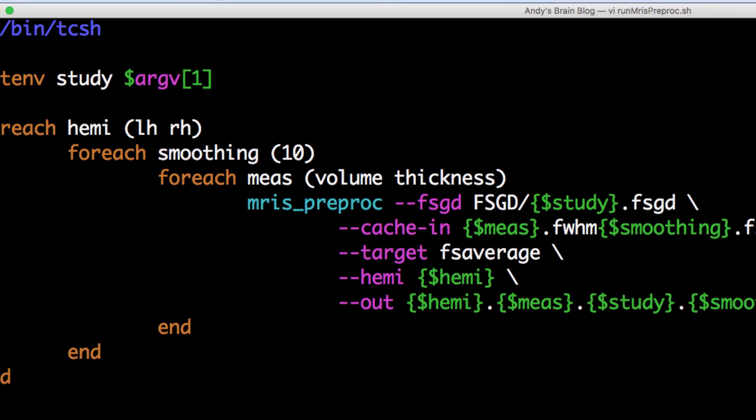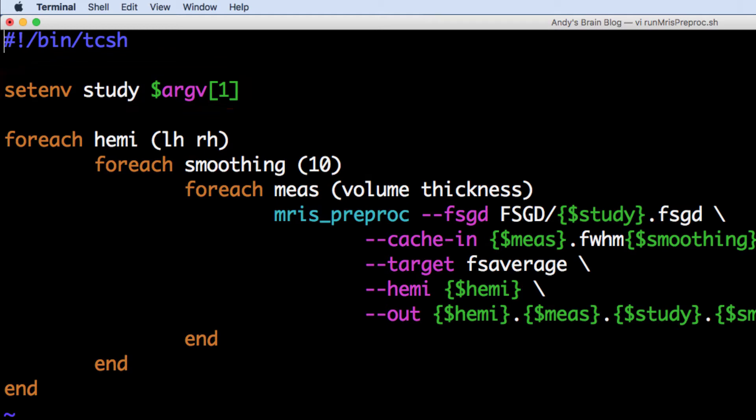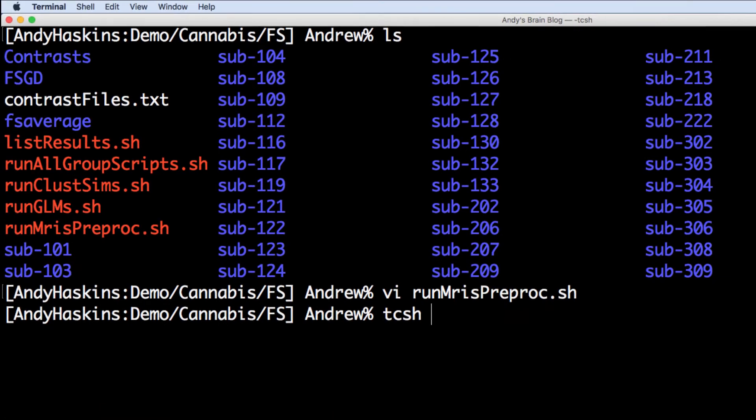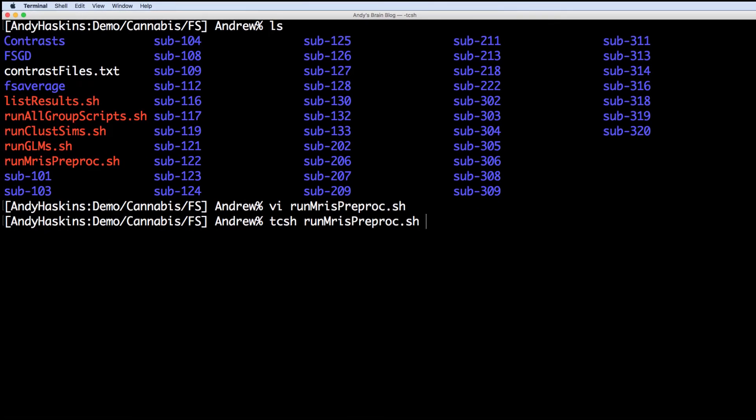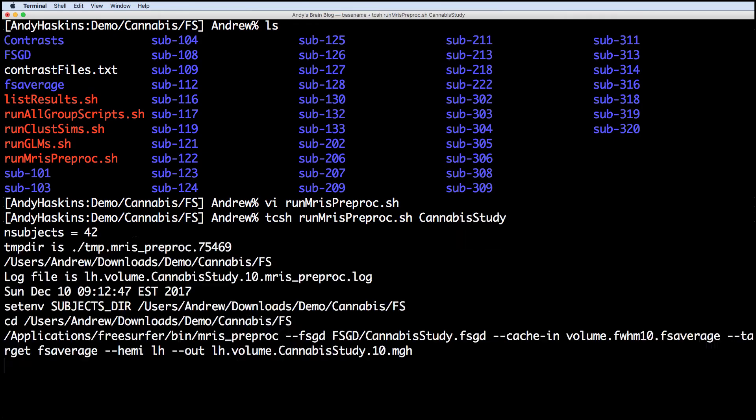This script takes the study name as an argument, which is the name of your FSGD file. Here, I've called it cannabis study, so run it with tcsh runmrispreproc.sh cannabis study.